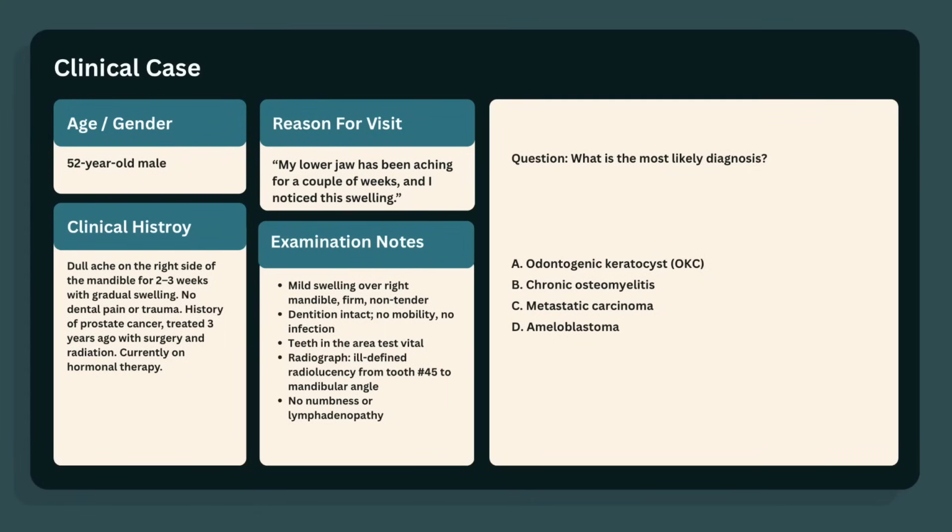Hey guys, in this video, we're going to take a look at a case that really tests your ability to connect the oral exam with the medical history. It's one of those that might look subtle on the surface, but if you miss the context, you'll totally miss the diagnosis. So yeah, let's jump right in.